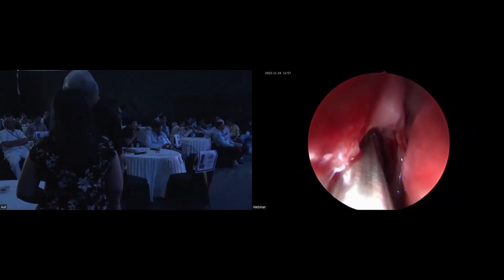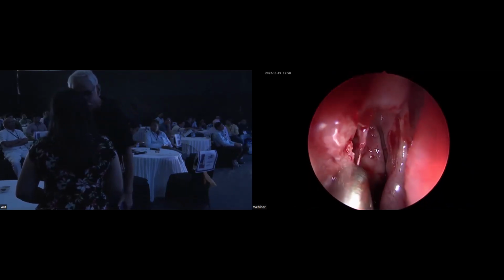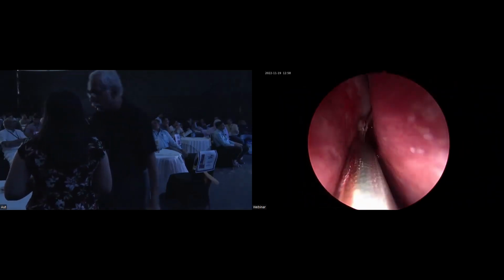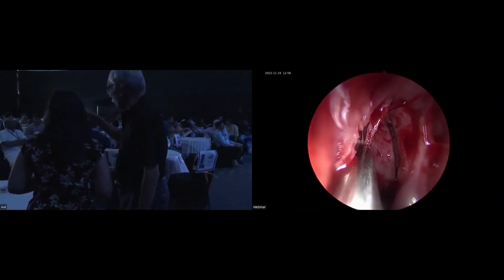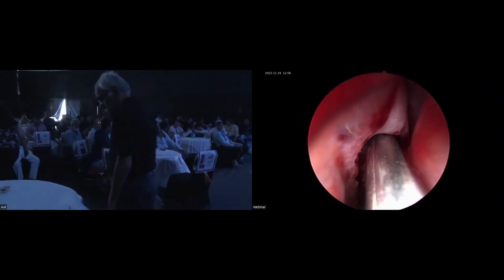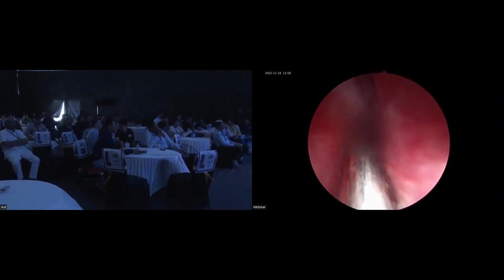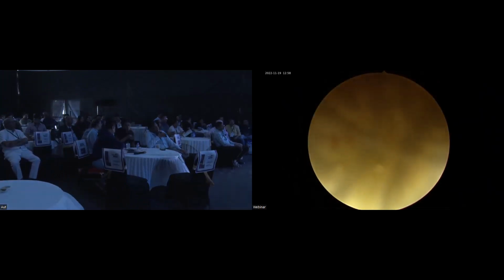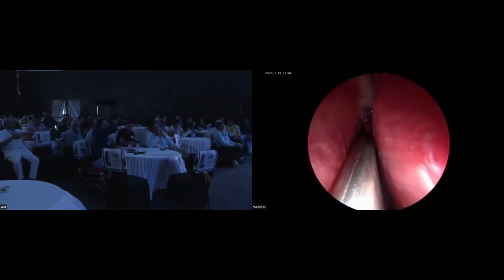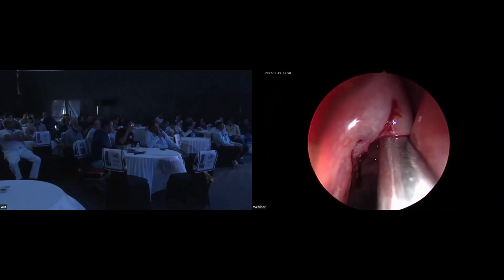Okay, you're seeing the bulla. Who's at the mic on the other end? 70 scope. Dr. Helale? Yes, ma'am. Upper. Yes. So I'll try and show upward. Just give me one Merocel with adrenaline and switch my 70-degree scope and double curve suction.